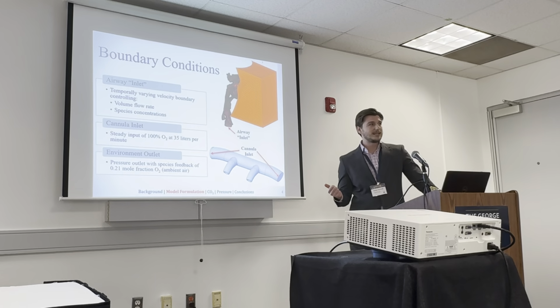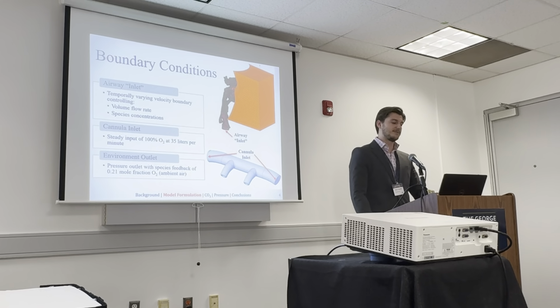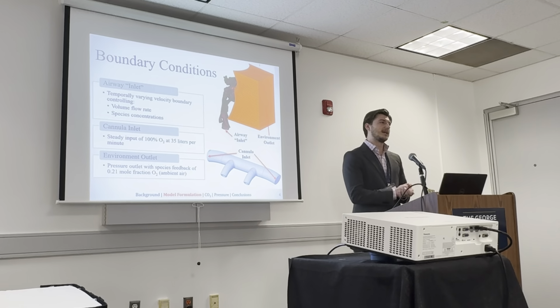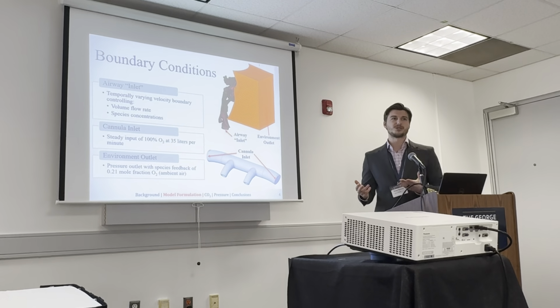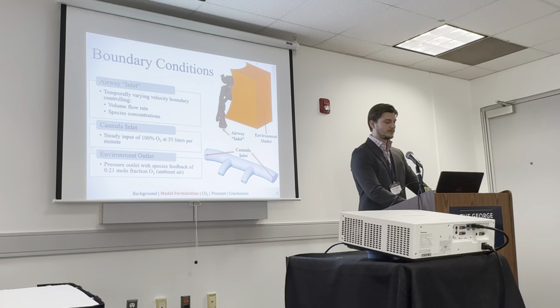Moving to the cannula inlet, this is just a steady input of 100% dry oxygen at 35 liters per minute, and then the environment outlet is just a pressure outlet with a species feedback of 21% oxygen, so this is essentially just ambient air in the room.